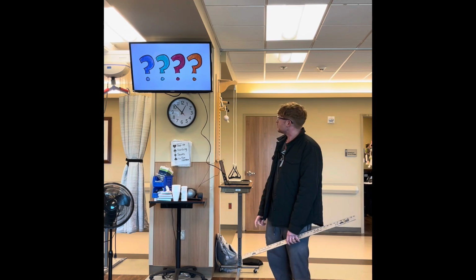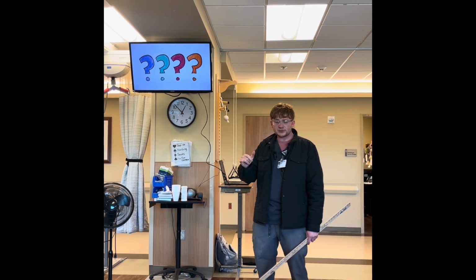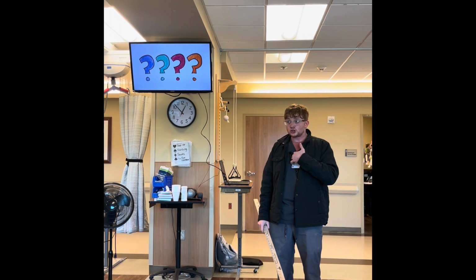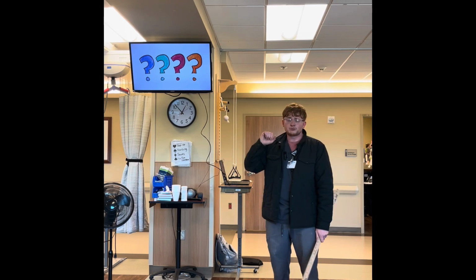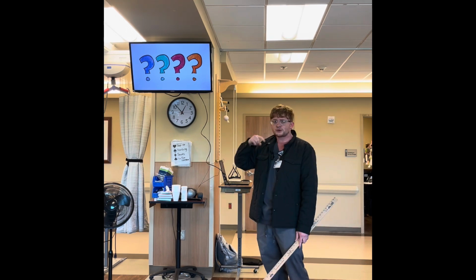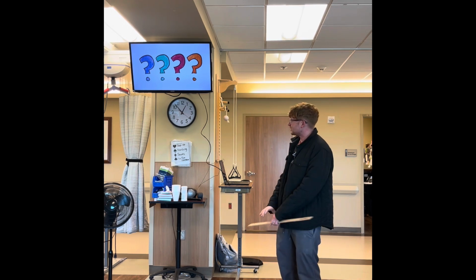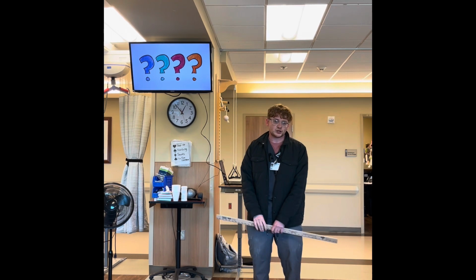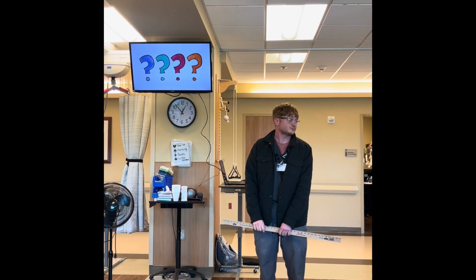That would also depend on the kind of aspiration, because there's not always. Ideally, you would want repeat imaging, but if they were showing overt signs, you took them in there, you figured out what was causing it, and you could assess the overt signs at bedside. A bedside might be sufficient if you feel like they have been working with therapy and getting stronger. But probably utilizing precautions too until you can get the imaging. But if you got them in for imaging to get the sure thing to get the upgrade, if you had overt signs, you could use the bedside, but the imaging is probably the safest way to go once you've already recommended therapy off of the imaging to see the best progress.